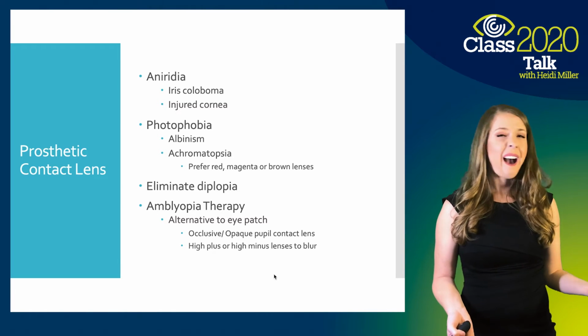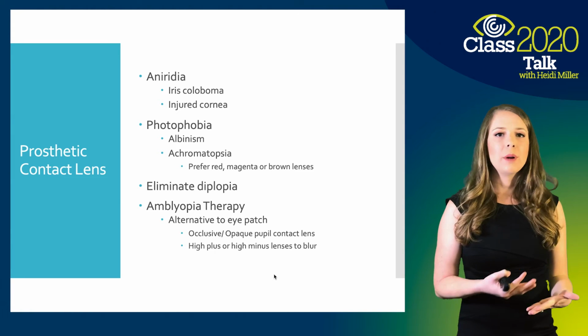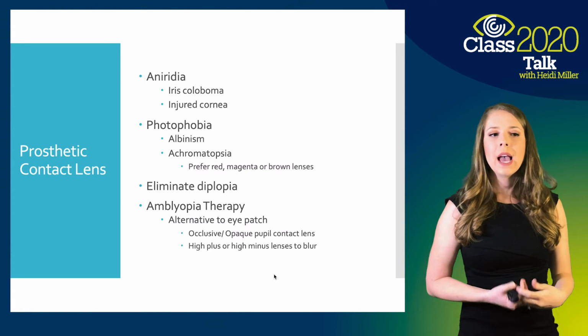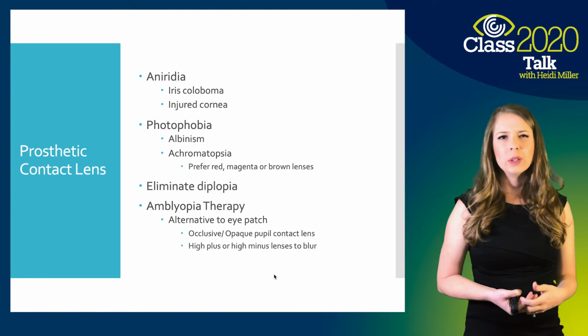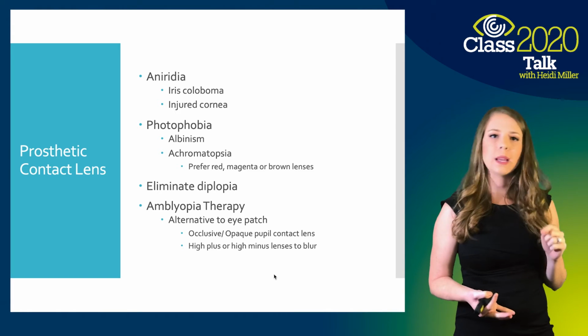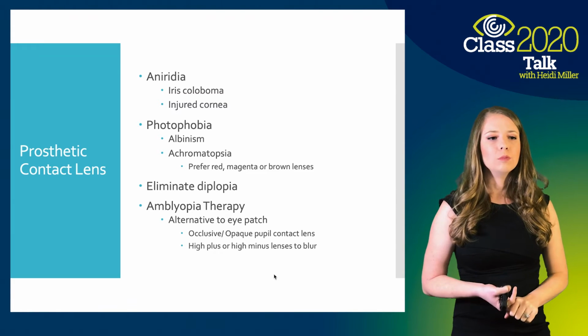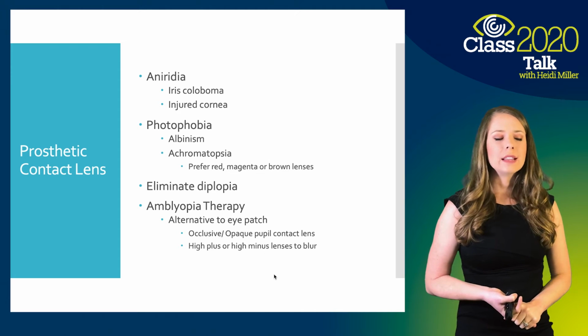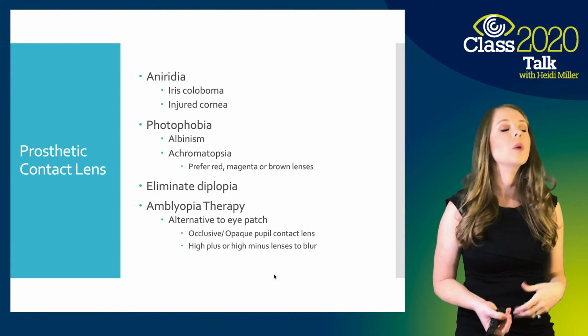I tend to not have issues doing the opaque pupil, but you will decide kind of preference there and what you prefer doing. There's a lot of labs that do opaque pupils, so there's no real limitations there, but I know cost sometimes can be a factor or cosmesis can be a factor and replacement schedules and things like that. So you'll just have to kind of tailor towards the patient and the family and see what works best for them.